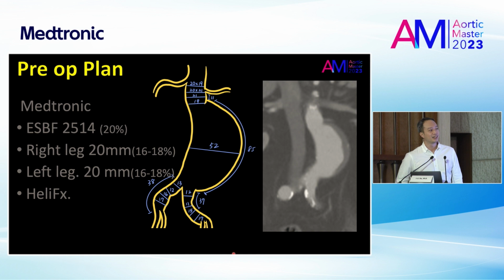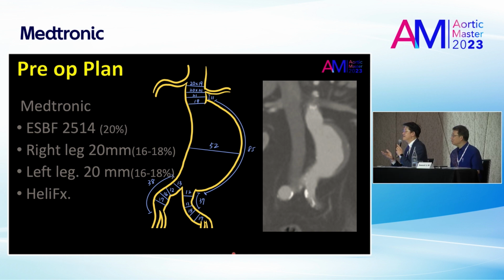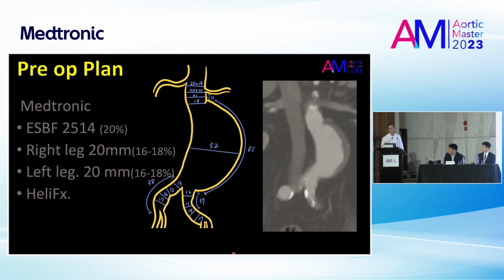Okay. Dr. Vitawat or Dr. Wang, do you have any comment or any question? Right now, how many cases have you performed with primary treatment with the endo anchor, and what are the indications? Not many. In my personal experience, only 3 or 4. Until now, I haven't met such a complication like Dr. Wang described before, where you push the outer wall away from the stent graft. So I'm just lucky until now. Thank you.